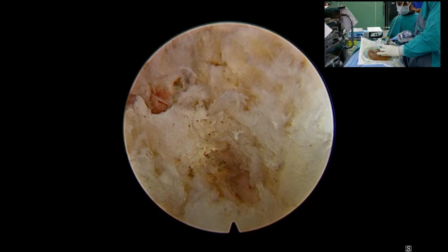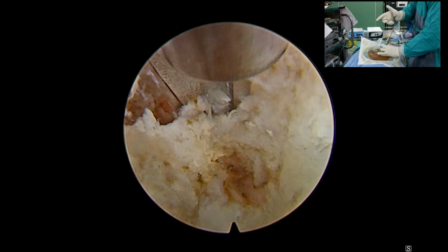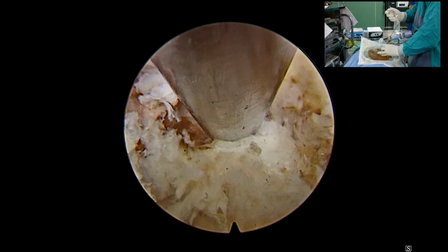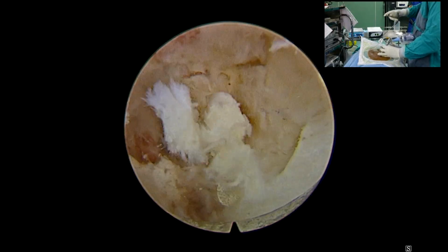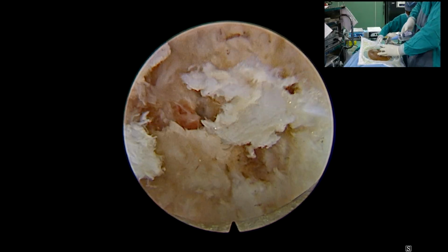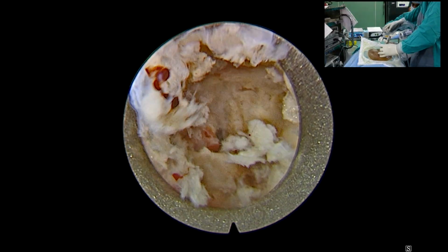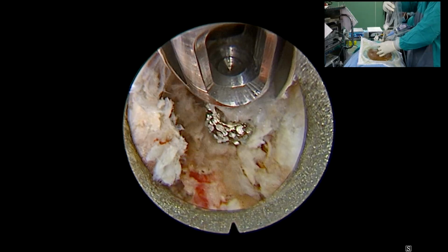Nibbling means we are just cutting it, very similar to burring. Currently we are using a 2 mm Kerrison punch. In a Kerrison punch, the foot plate plays a very important role, so the foot plate should be as thin as possible.